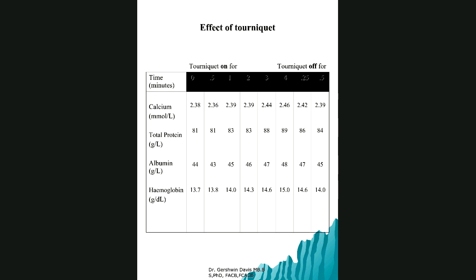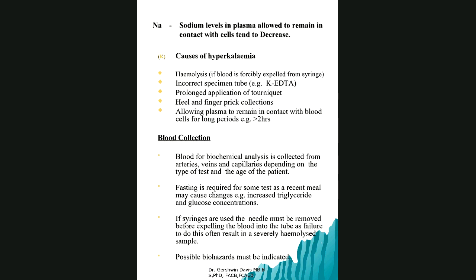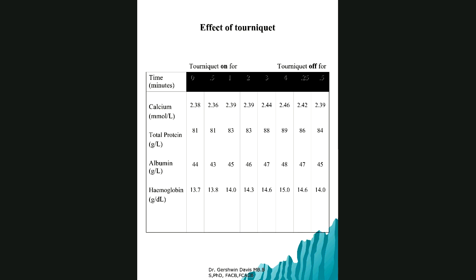You see, effect of tourniquet, we have one after that. Okay, so let's look at the other one, pre-analytical effect of tourniquet. Correct, right? Good. So effect of tourniquet, I'll keep quiet for another minute or so, and then we'll come back and discuss it. Remember, all of these are pre-analytical errors, so you should have in your mind a list of examples of pre-analytical error.